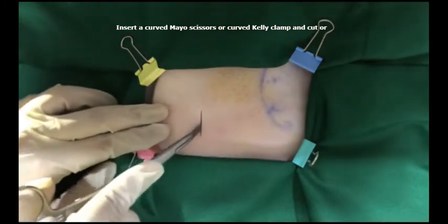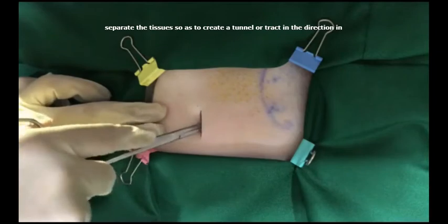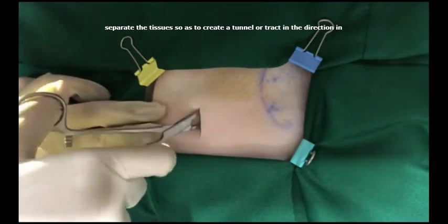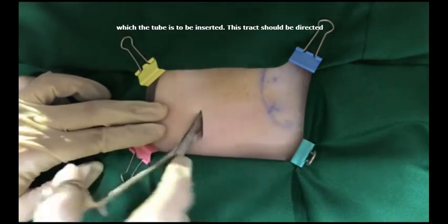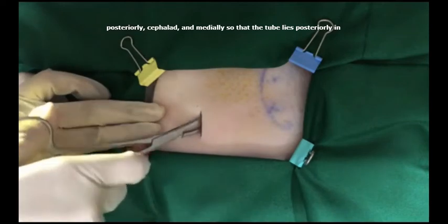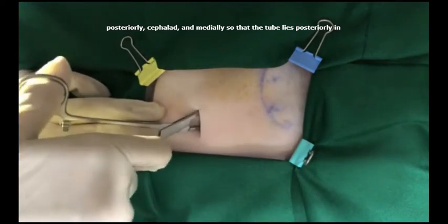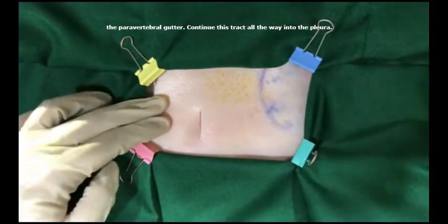Insert a curved Mayo scissors or curved Kelly clamp and cut or separate the tissues so as to create a tunnel or track in the direction in which the tube is to be inserted. This track should be directed posteriorly, cephalad, and medially so that the tube lies posteriorly in the paravertebral gutter. Continue this track all the way into the pleura.